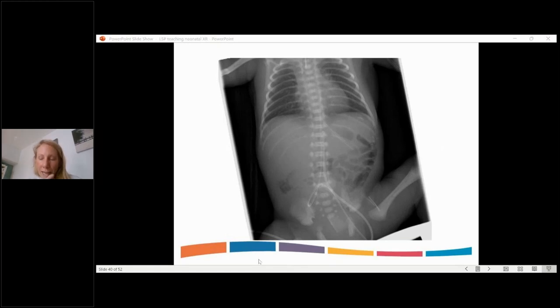And this was missed. And the reason I'm highlighting these is because they are the sorts of things that are very easy for us to see. So yeah, Bolla has highlighted that the UVC is going on the left. It is, but this is where rotation is important. So this is probably a very rotated x-ray. One leg is here and one is here. But yes, you would be worried about that UVC.